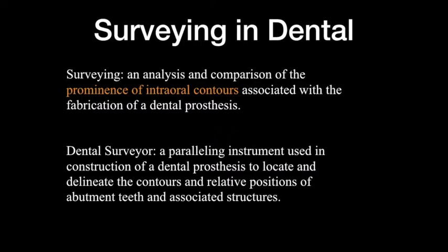of a dental prosthesis. So basically, you can think that surveying is to measure the height of contour. And the dental surveyor is an instrument to help you do a surveying.